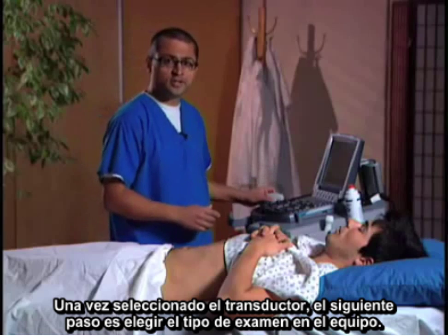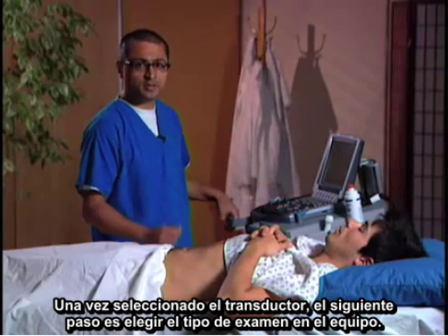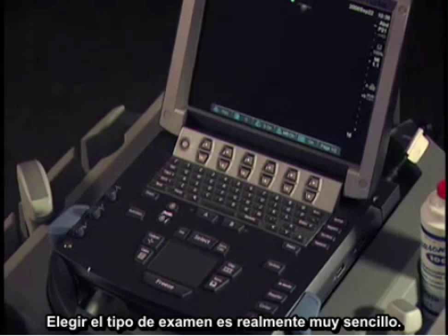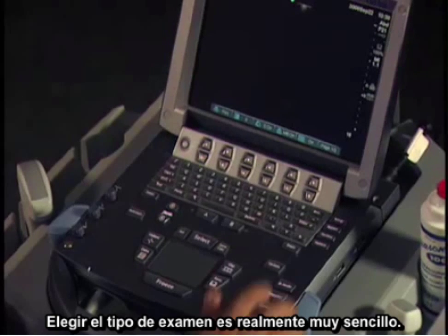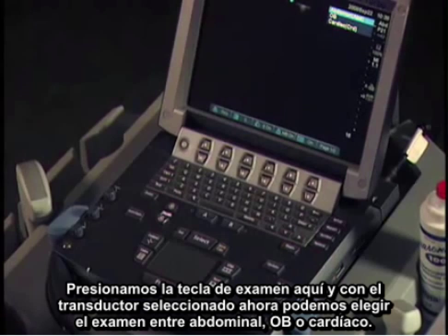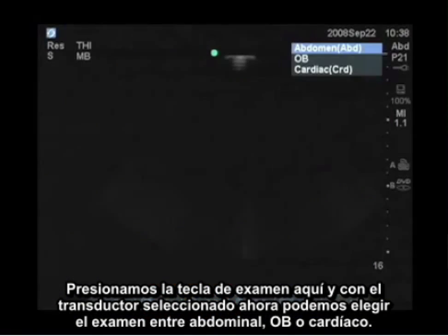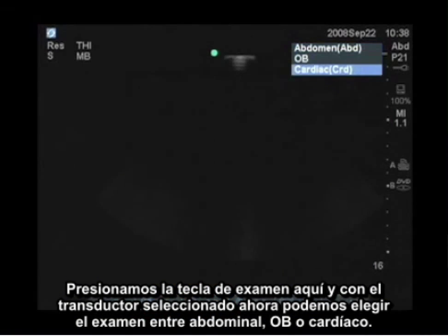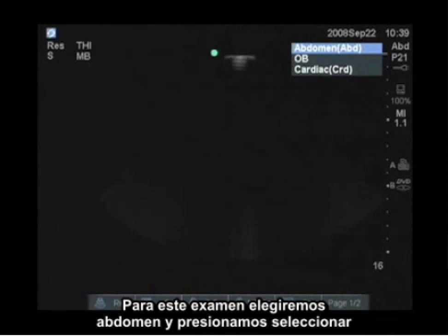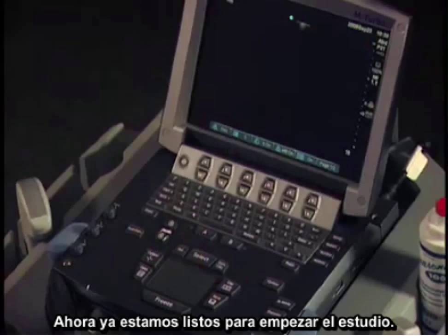Once you've chosen the transducer, the next step is to choose the exam type on the machine. To choose the examination configuration, we hit the exam key right here. With the selected transducer, we can choose between abdominal, OB, or cardiac. For this exam, we're going to choose abdominal. Hit select, and we're ready to start scanning.